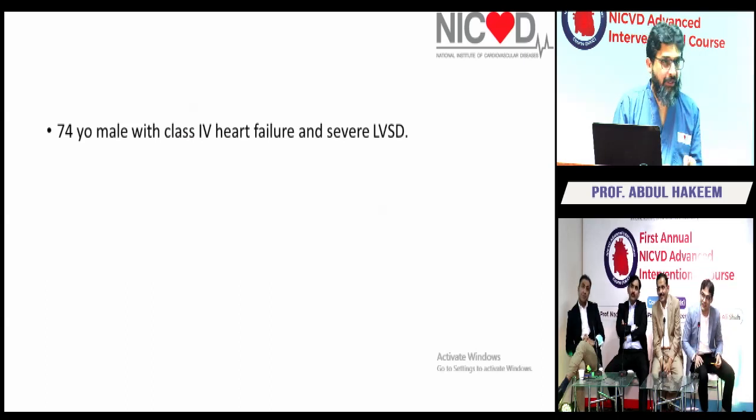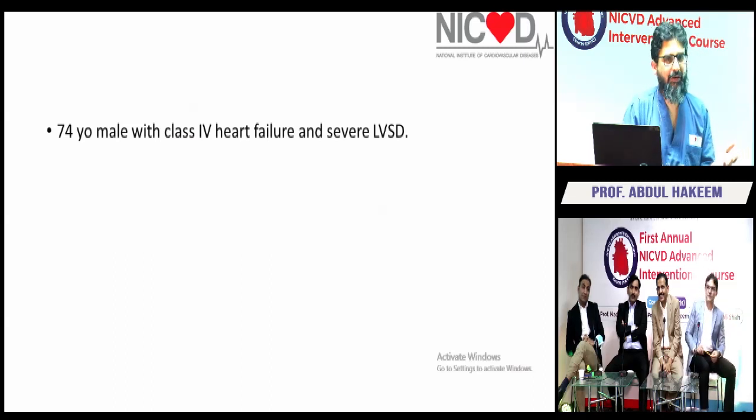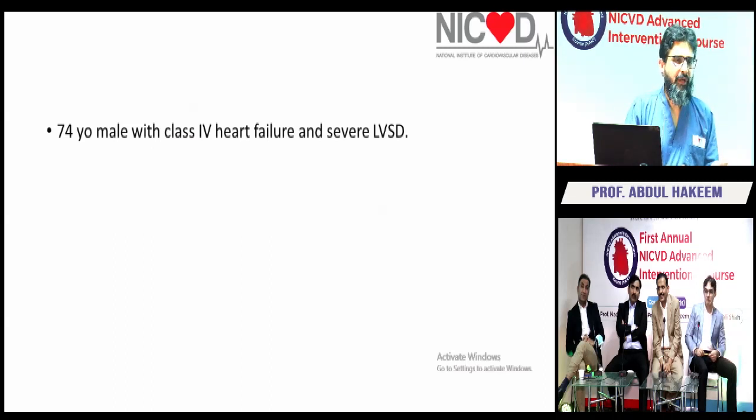Sohail Khan is a magician. This patient did have a suicide ventricle. Who saw this patient in post-op? They called me and said, oh, the patient is extremely hypotensive. So obviously, if you've just done a TAVR, the patient's in the recovery area, and they call you that the patient is very hypotensive, what are the first 3 things you've got to rule out? 1, 2, 3. So you want to make sure there's no vascular issue, okay? So groins are fine, you send a stat hemoglobin, right?